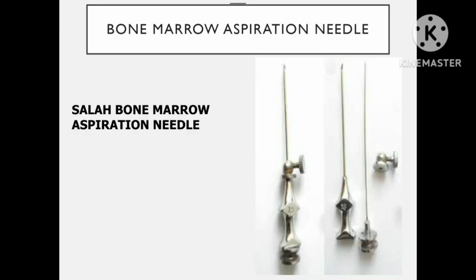Next is the bone marrow aspiration needle. This is Salah's bone marrow aspiration needle. It has the parts: the trocar, the cannula, and the adjusting part, which helps to know the depth of penetration of the needle.